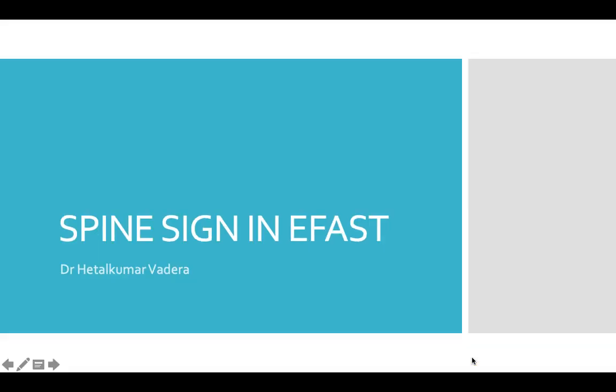Good evening, friends. Today we are going to talk about spine sign in EFAST.